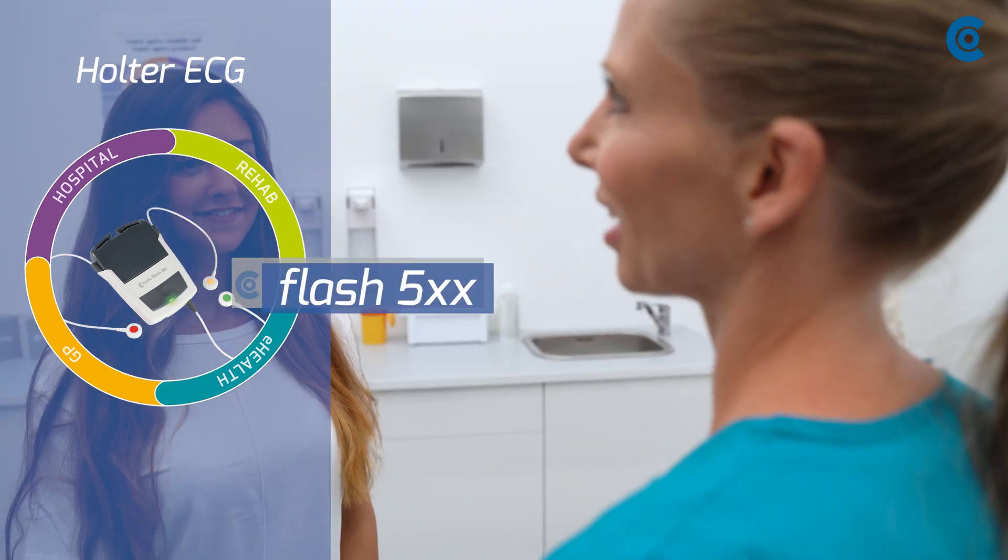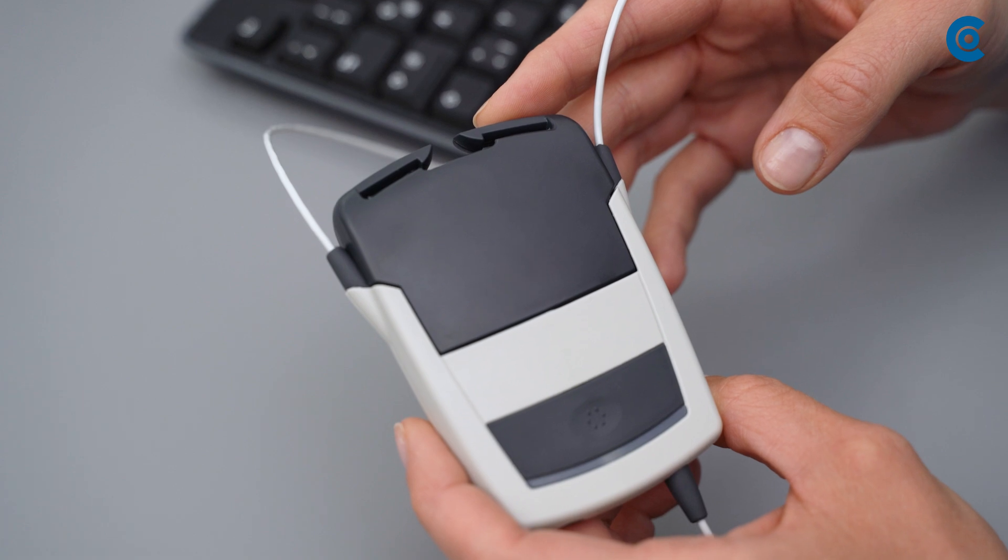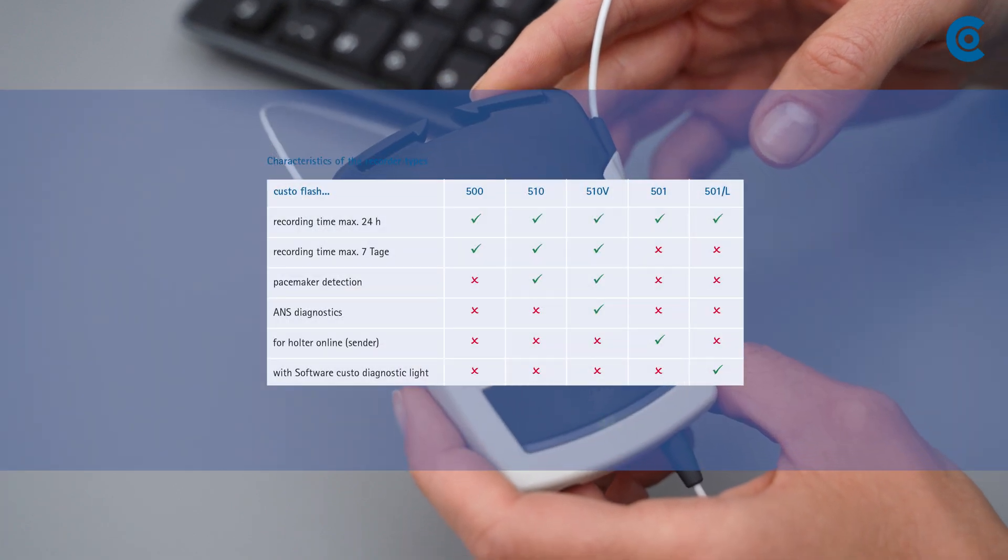The following video shows you how to perform a Holter ECG with the Custo Flash recorders by CustoMed. They are available in several versions.